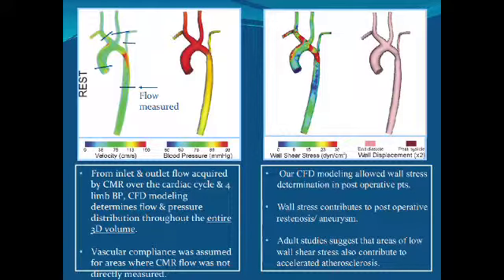The only flow measurements I provided to Marquette were inflow measurements and outflow measurements. And yet, somehow or other, John was able to create this model of velocity using that discretized method that we showed you. So we gave him a few areas of data, and then he was able to model flow anywhere along the entire 3D volume set, which was, to me, sort of interesting. It's like, wow, isn't that interesting.